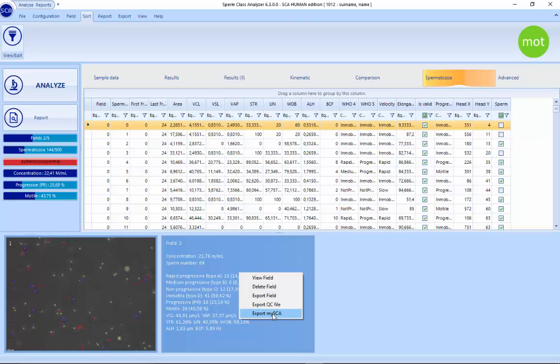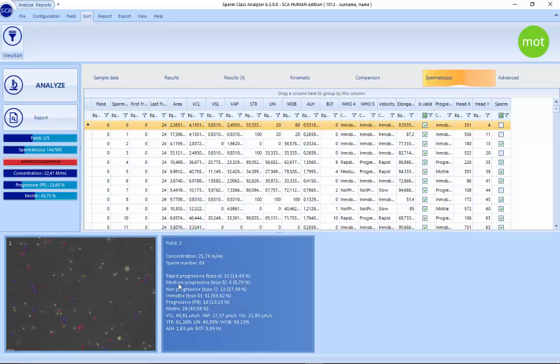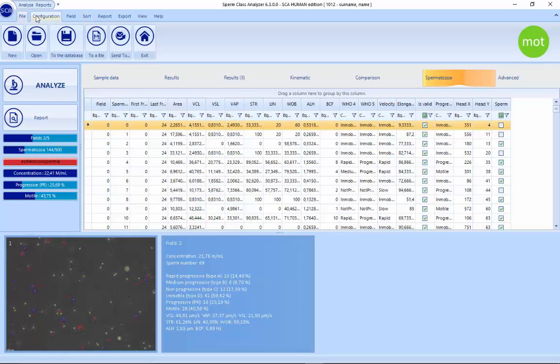It's also possible to export to MySCA. This is a cloud space with unlimited storage for customers — it's a private space where you can export all the videos, files, or results. It's also possible to save directly to the database or to a file. The saved file will include all the videos and all the configurations you analyzed, and it can be viewed with the viewer or sent to another customer.